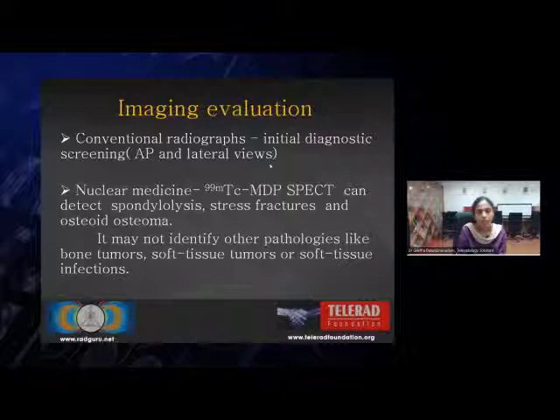The AP and lateral views are done. Nuclear medicine, technetium MDP SPECT, can detect spondylosis, spondylolysis, stress fractures, and osteoid osteoma. It may not identify the other pathologies like bone tumors, soft tissue tumors, and soft tissue infections.